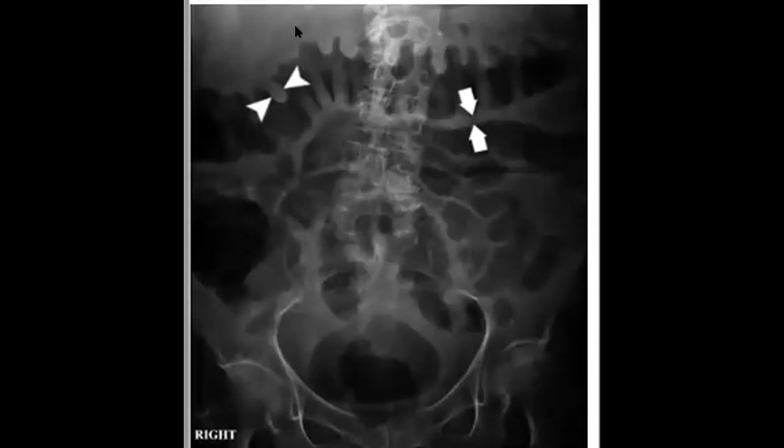Okay. We were talking about rapid reporting, and one of the important issues for the FRCR or EDiR short cases is that you should recognize the acute conditions, especially in the abdomen, the gases and so on.